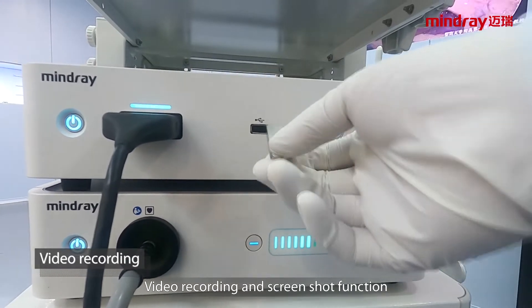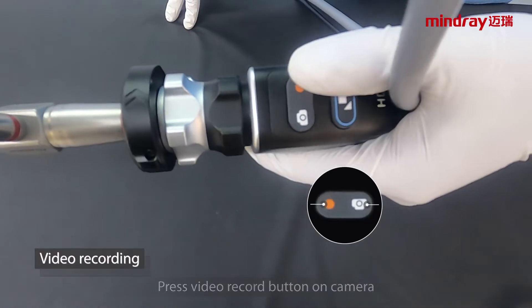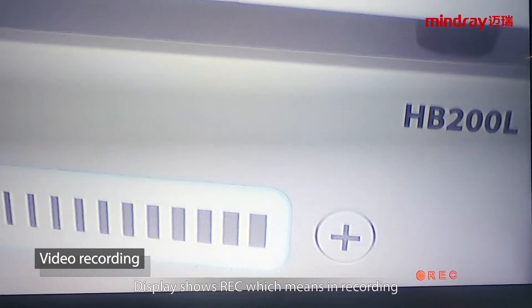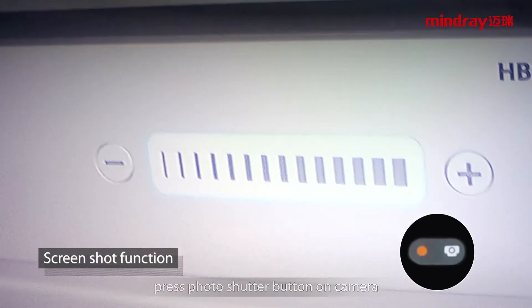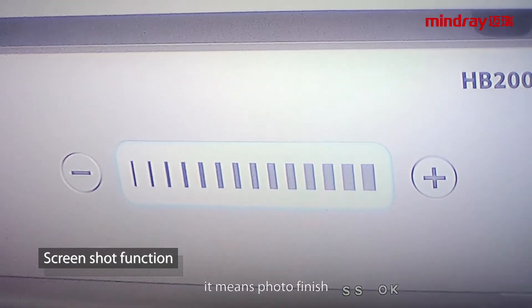Video recording and screenshot function: insert a USB disk formatted as FAT32. Press the video record button on the camera; the display shows REC, which means recording is in progress. Press the record button again to stop recording. Press the photo shutter button on the camera; the display will show SS busy and SS OK, which means the photo is finished.